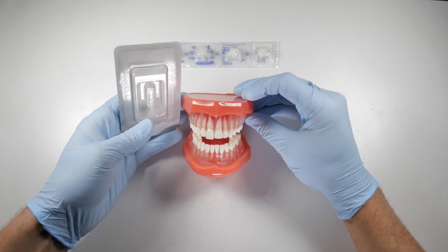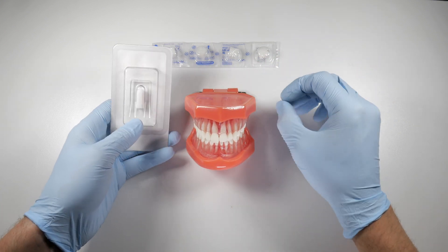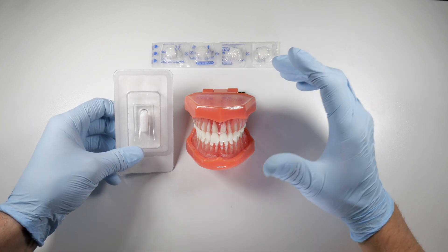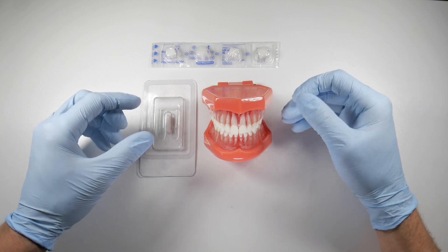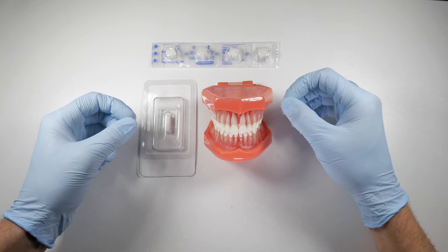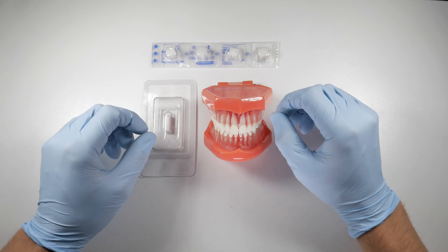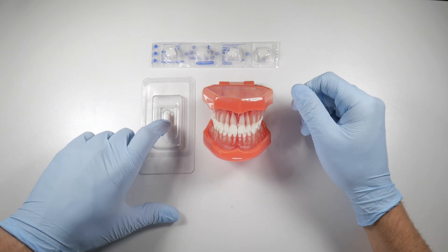I've never understood why gel foam comes as squares. You can squish it and ball it up to get it in there, but it's more difficult to work with than a coloplug. When you're placing something into a site that's bleeding at a moderate pace and trying to get it sutured over with pressure on it, coloplugs are way easier to work with.